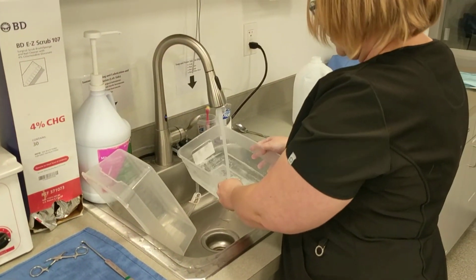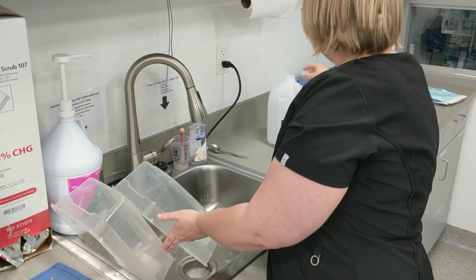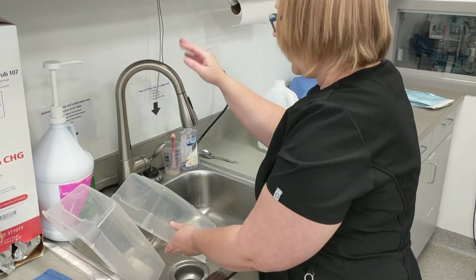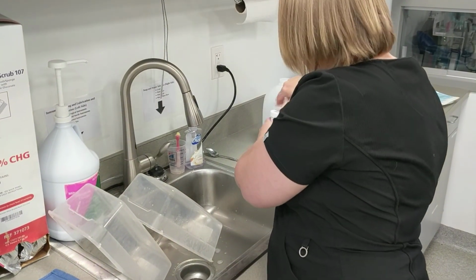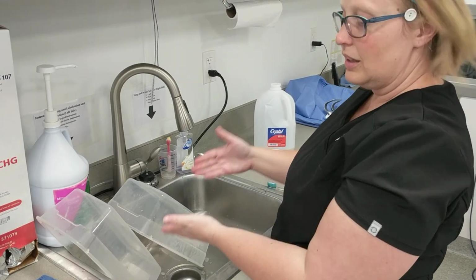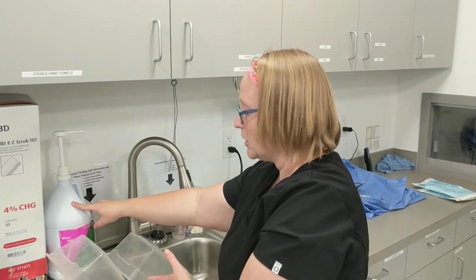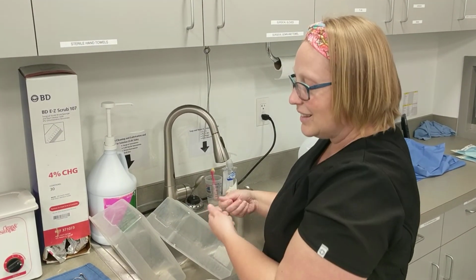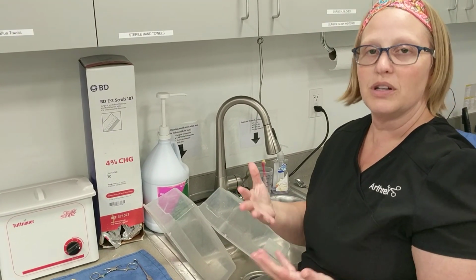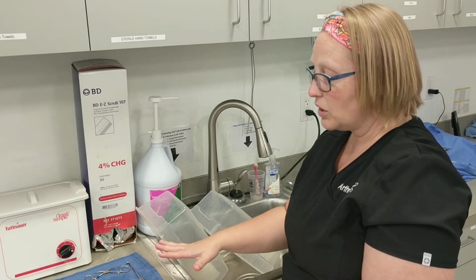From here, I am going to rinse my bucket with the distilled water and leave that there. Close up my bottle. I have to wait for my timer to get done to do that again. But that's the kind of basic instrument cleaning there: scrubbing the tools, putting them in the lubricating instrument cleaner and lube, letting it sit in there for a second, taking anything that might have been missed, any of those fingerprints, any of those things from the first initial scrub down, and then we're going to let them dry.